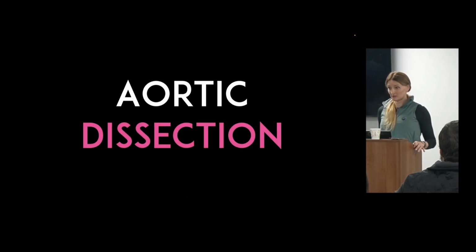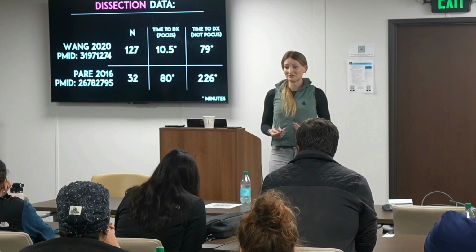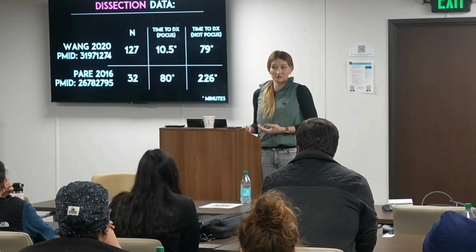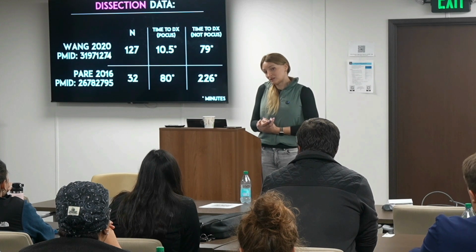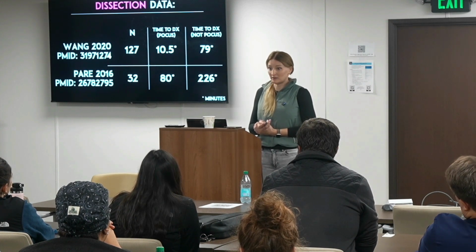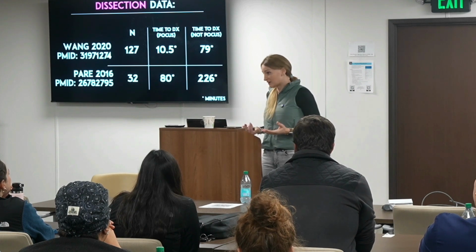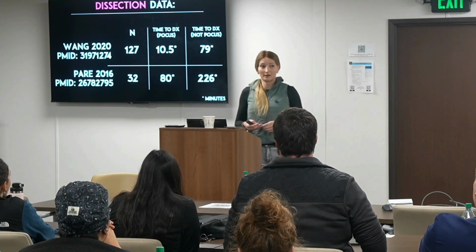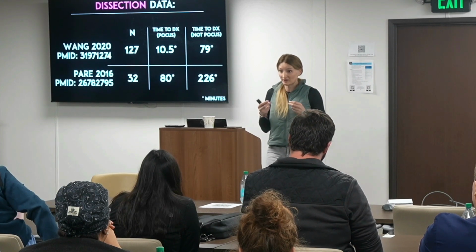Why do we do this? Like, why not just send them to CT scan? We might not have time. It's faster, and there's data to show that, which I want to be very clear. I obviously am very invested in ultrasound. It's like the thing that I know the most in medicine. And when you guys have worked with me, there's some shifts where I don't ultrasound that many people, right? Because I use it when it's beneficial in that patient. Sometimes academically, I'm just curious or I want to try something out. But we use it when it's useful, and this is why this specifically is very useful.